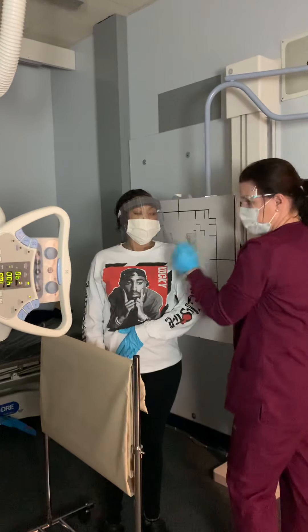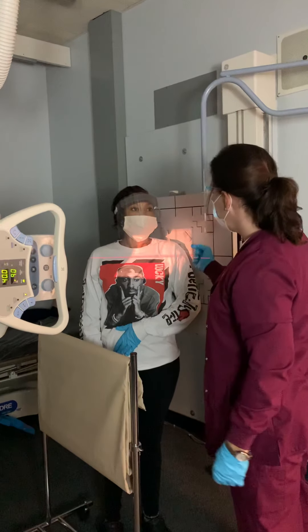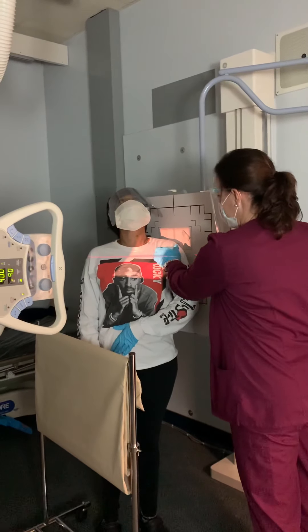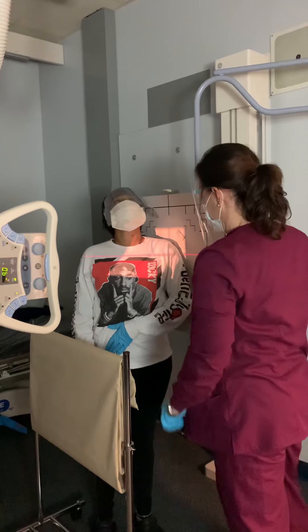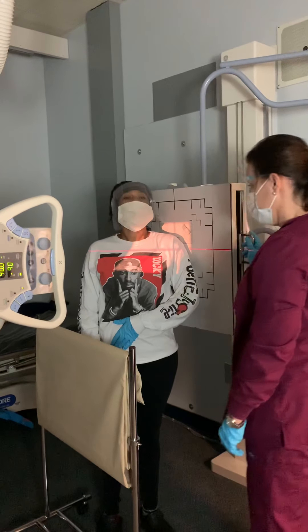Come in and bring your marker in. Shield your patient. If they have a face shield on, we can get them to look up. Hold your breath, don't breathe, don't move. Beep. All right, you can breathe and relax. So that's the Grashey.